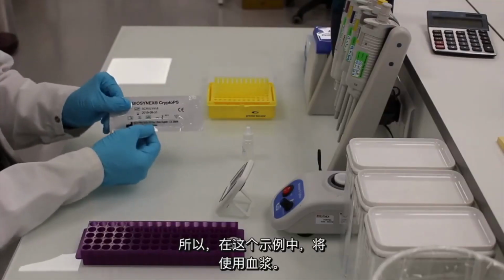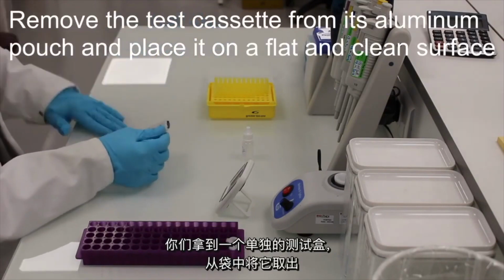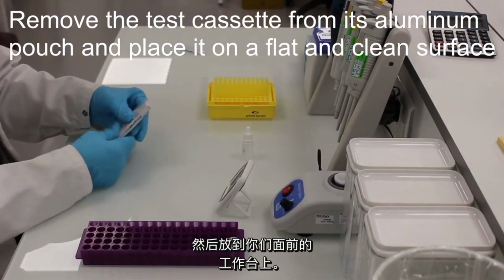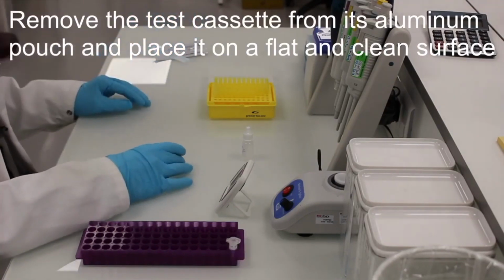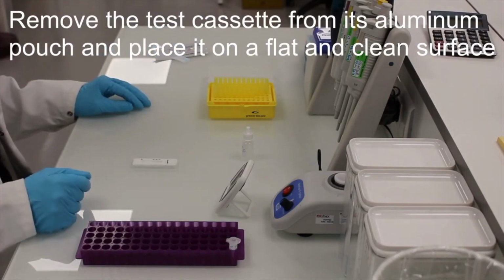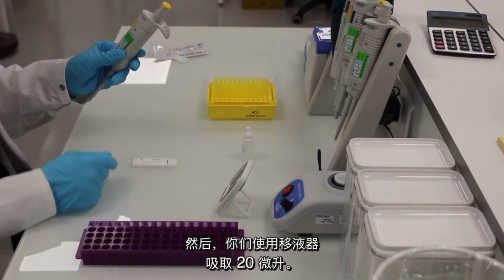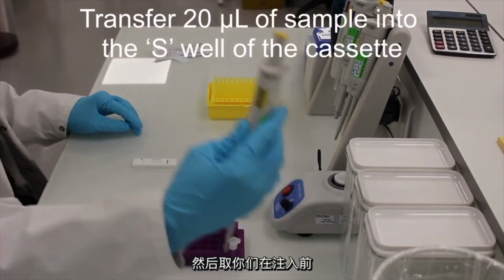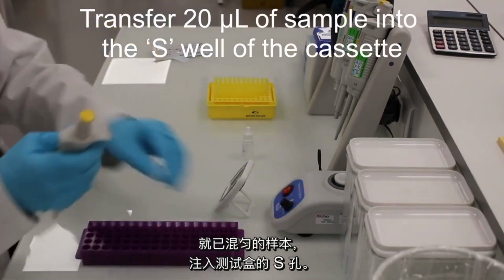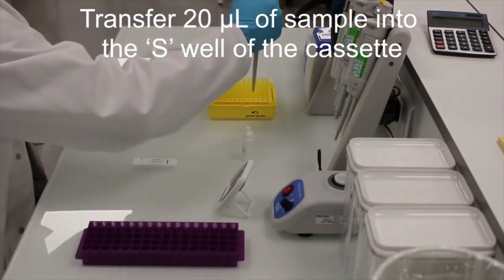In this example, plasma is going to be used. You take an individual cassette and you remove it from its pouch and you place it on the bench in front of you. You then use a pipetter that allows you to pipette 20 microliters, and you take your sample, which you vortex prior to insertion into the S-well of the cassette.